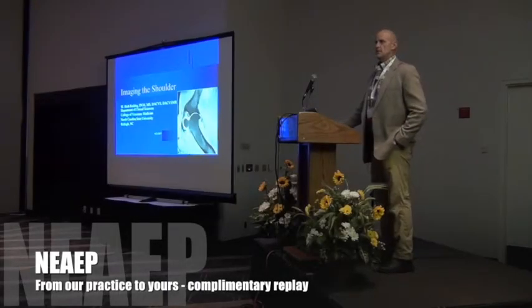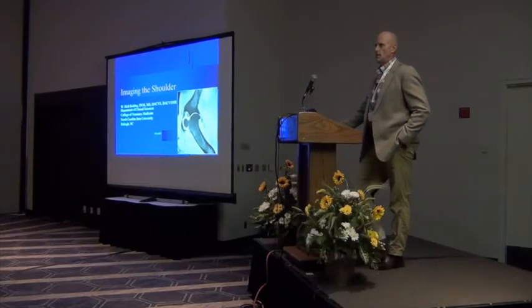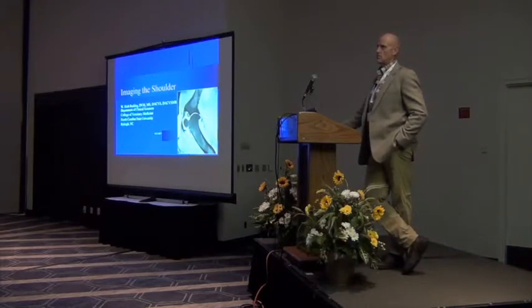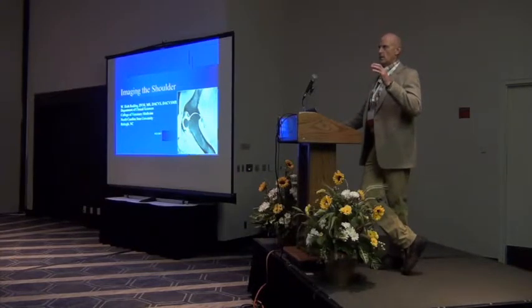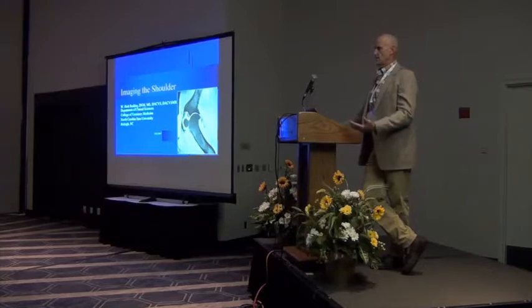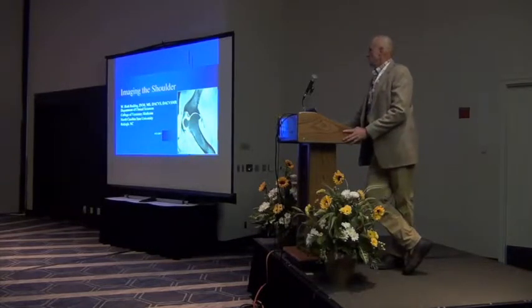Predominantly the shoulder region, and maybe we'll get into the antebrachium to a certain extent. Sometimes it's hard to differentiate things without spending a lot of time working through the whole process. And this is really going to be a multimodal approach at the end, showing you how to use all the different things.